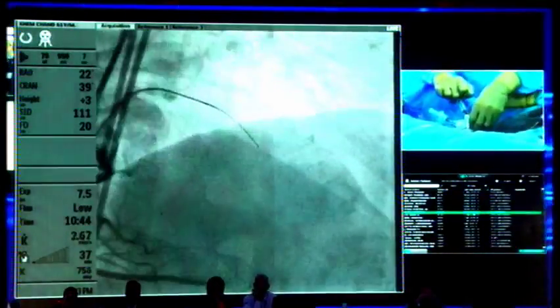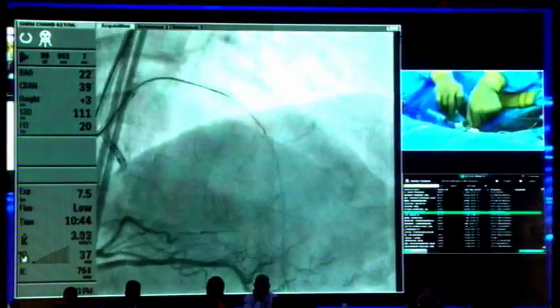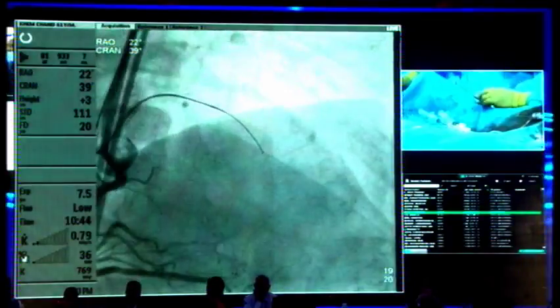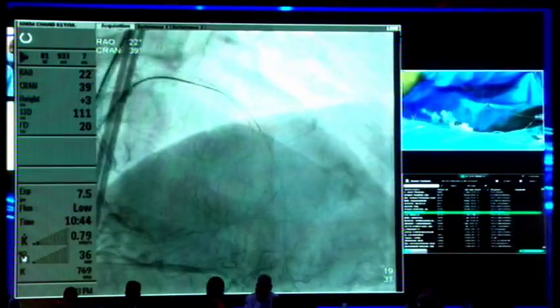The wire is actually in the middle part of the stent. You cannot tell by one shot. Actually, we have to take a minimum of 2 angiogram shots. Then only we can tell, because we may think it's inside the stent.